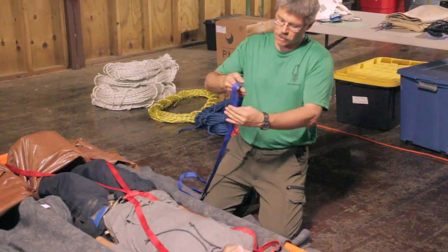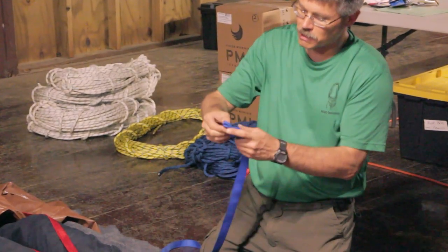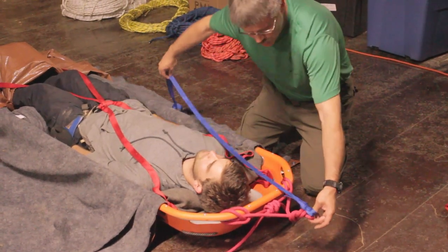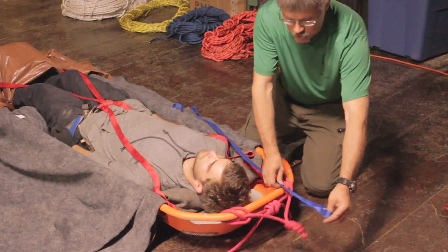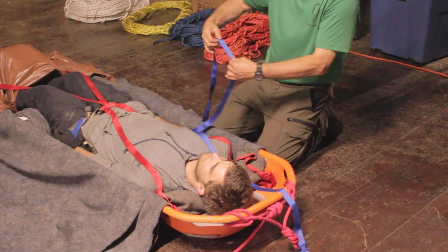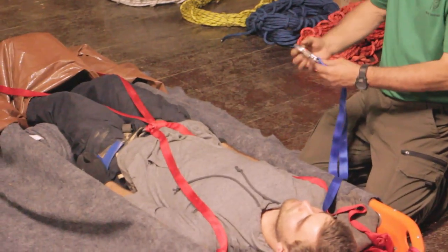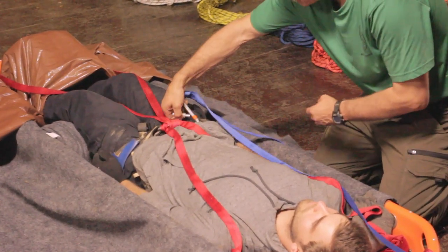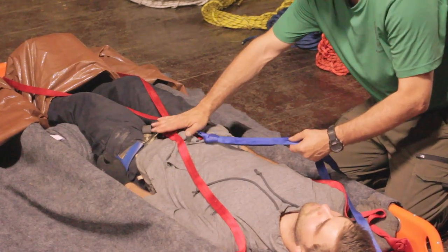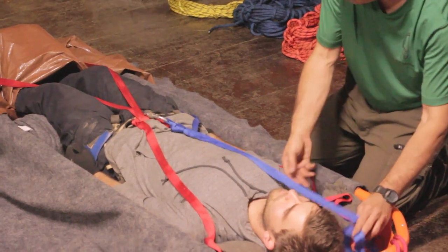This is the ultimate fail-safe in case we have abrasion of our attachment points that might cause those to fail. I'm going to start by making a water knot or an overhand bight at one end of an approximately 10-foot piece of webbing. I'm going to measure that out against the point of my upper bridle — my short bridle — but I know that in the process of loading the system, this is going to stretch and get longer. He may move a little bit in the litter, so when I measure this out to get my length, I'm going to add in about 6 inches plus a little bit more for my knot and make a second overhand bight or water knot. At NCRC, we tend to go ahead and attach that with a carabiner. This is all encapsulated in the packaging, and by years of experience, we know we don't have any problems with that getting cross-loaded. I'm going to tuck this in off to the side — it'll end up inside his packaging.